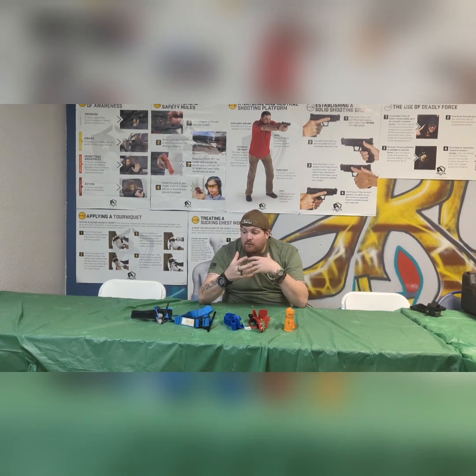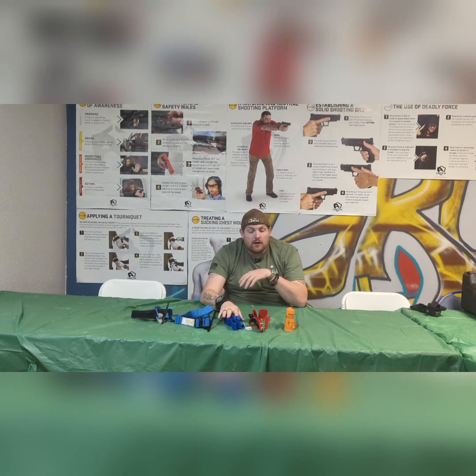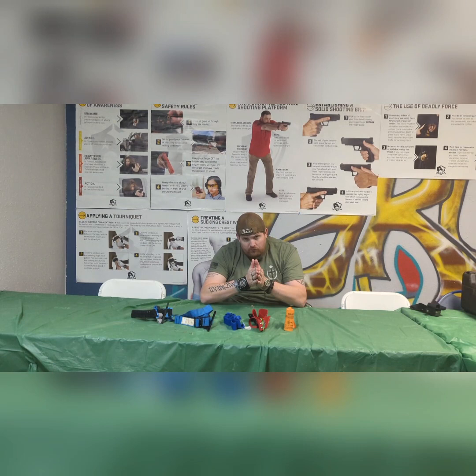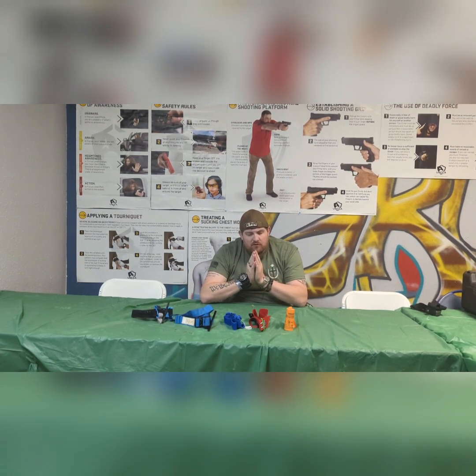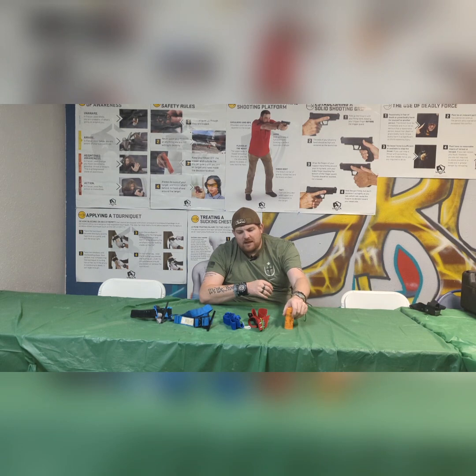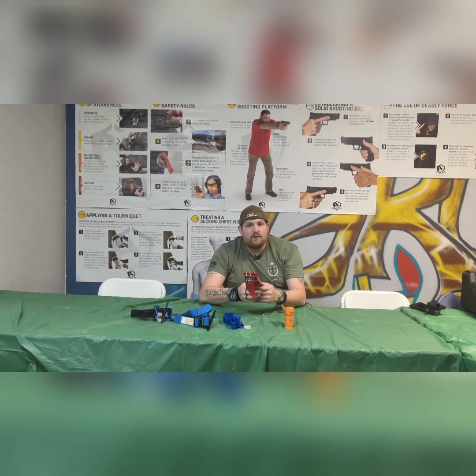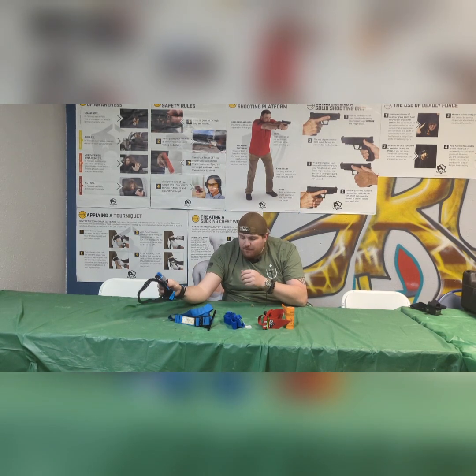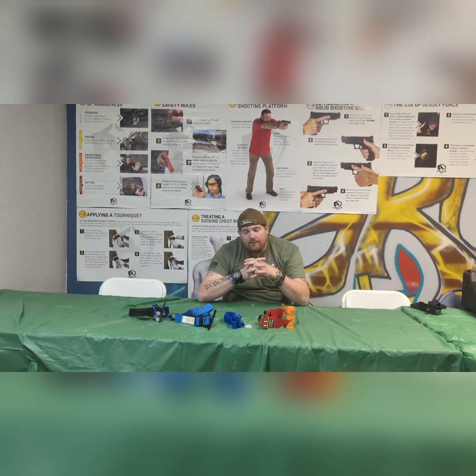My recommendation, and this is my thing, is get a trainer. First and foremost, if you buy a tourniquet, buy it from a legitimate source, even if it is on Amazon. Make sure it's a legitimate seller. Make sure it's from North American Rescue, from SWAT store, from Israeli First Aid. They're another great one. SAM, stuff like that. And make sure they're coming from a reputable source, because there are a lot of knockoffs now.